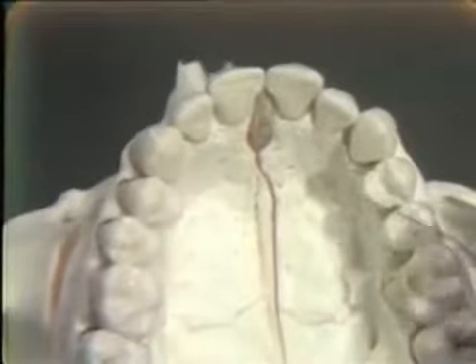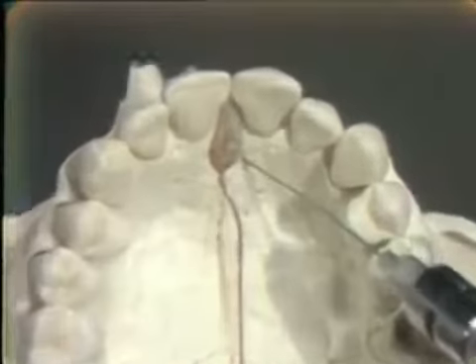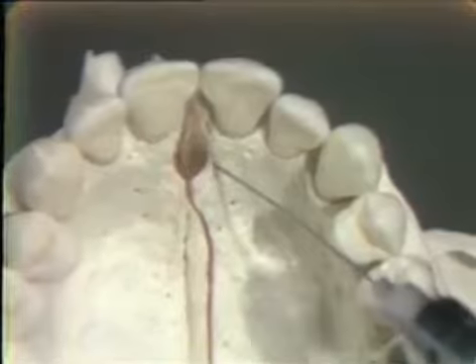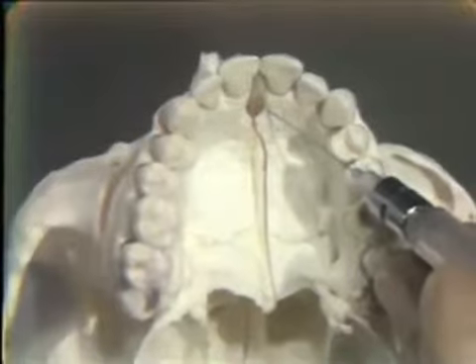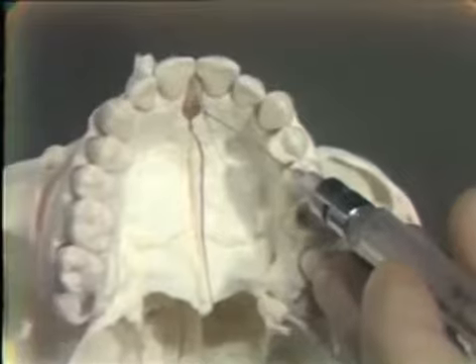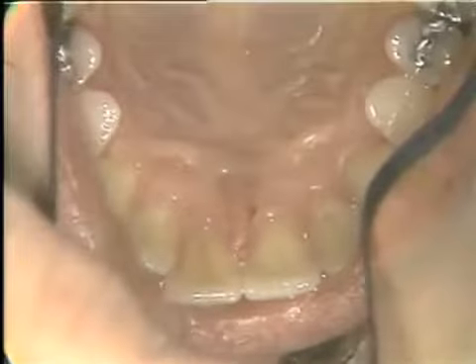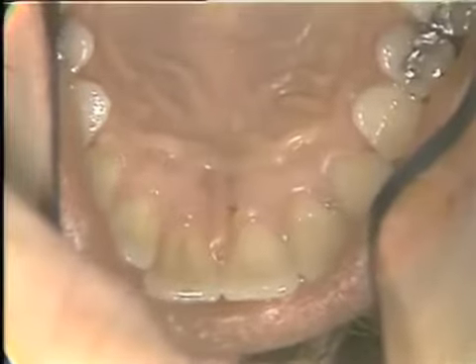So demonstrating that for us on either side, carried quickly into bone, aspirate, and then again it takes quite a little pressure on the plunger to get some solution out into these fibrous tissues, but again you will see them blanch as it occurs and know that you've accomplished getting some solution out into those tissues. This is a mirror view of the anterior palatine area, and you can see the nasopalatine papillae right here very, very nicely.